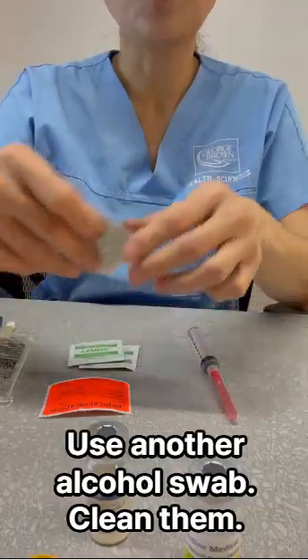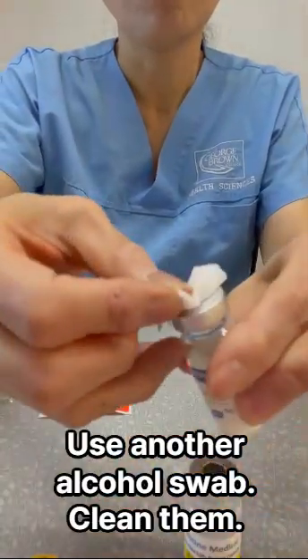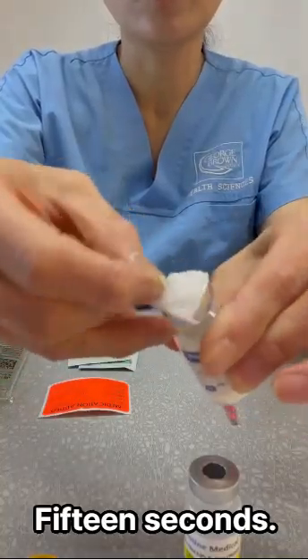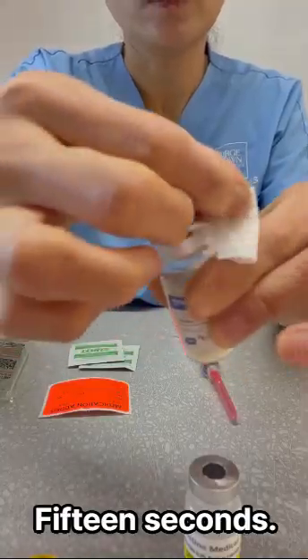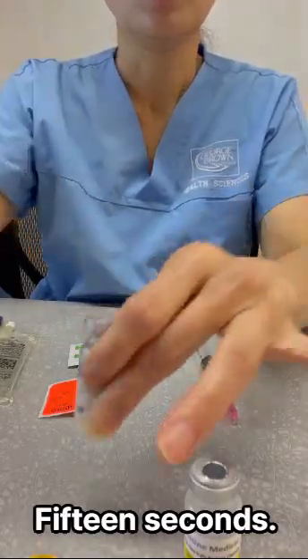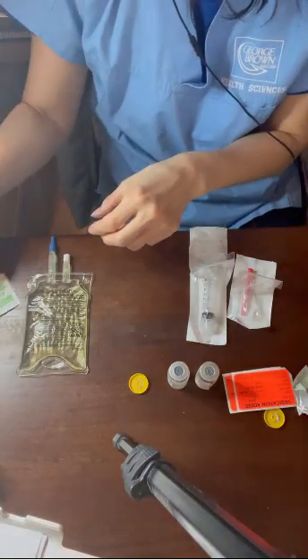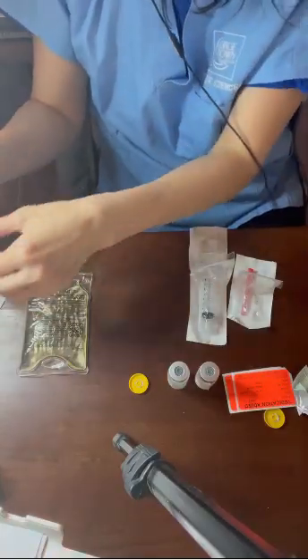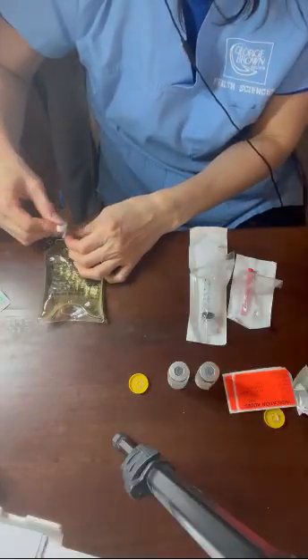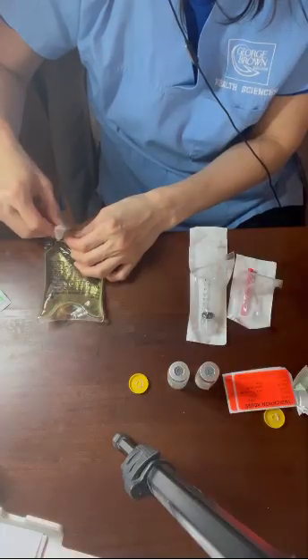Use another alcohol swab. Clean them for 15 seconds. And then dry them for 15 seconds. And I'll clean the normal saline 50 milliliter port area and use aseptic technique as well, and dry for 15 seconds.